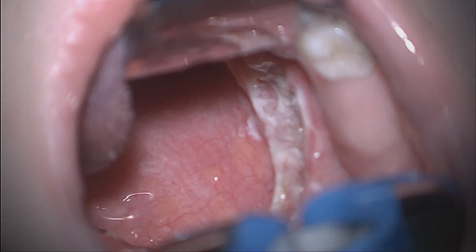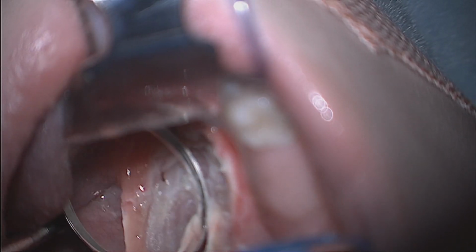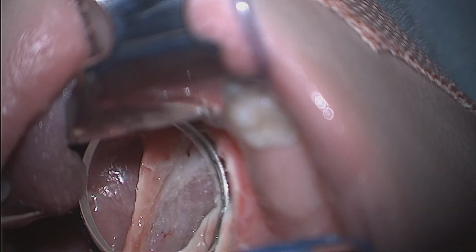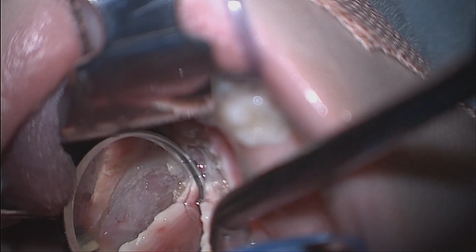The surgical bed on both sides are examined systematically, and once I am satisfied that hemostasis has been achieved, the gag is relaxed for 90 seconds in order to allow for any other blood vessels to reveal any further hemorrhage.